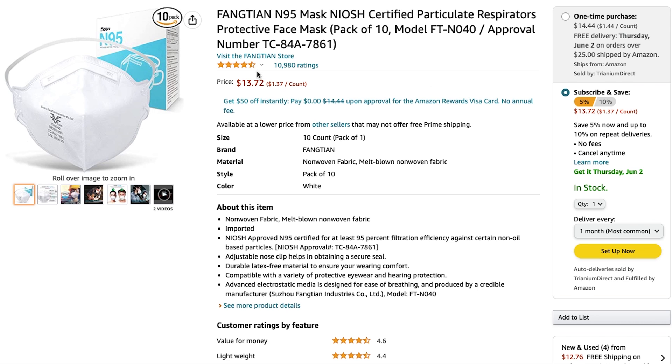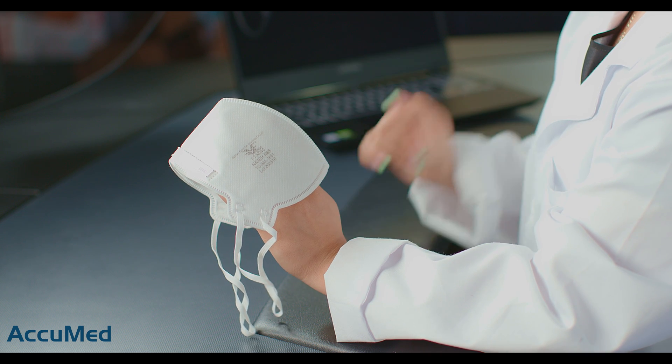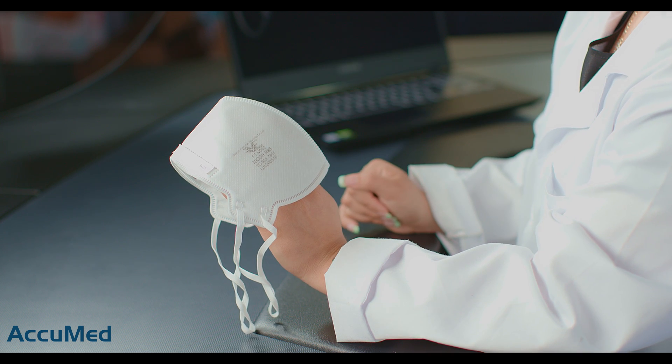They are also currently on sale and have a 4.3 out of 5 rating with over 10,000 reviews. These are being sold by the brand Fangtian, but according to the NIOSH approved N95 list, they are manufactured by Suzhou Fangtian Industries.